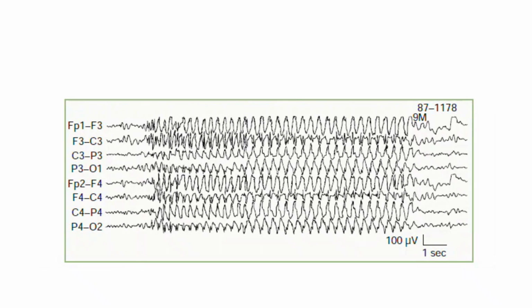Once a 3 Hz burst crosses the 3-second threshold, cortical processing is sufficiently disrupted to cause a complete absence of awareness. The rhythmic eye blinking, or minor facial automatisms seen here are common physical manifestations that sync rhythmically with the 3 Hz electrical pacing of the spike wave discharge itself.